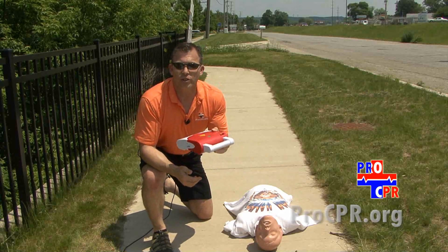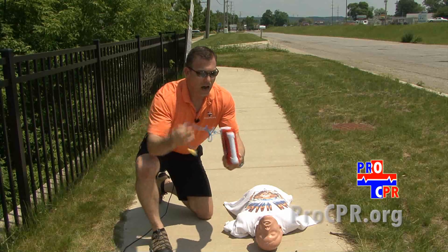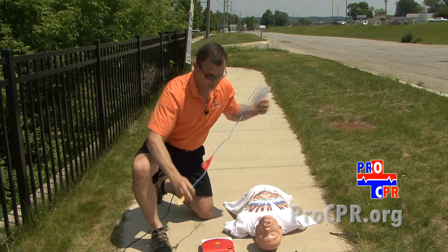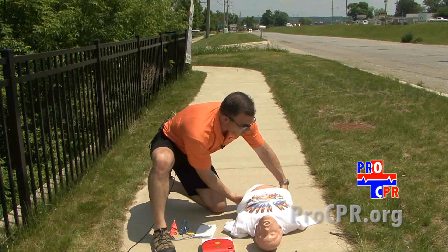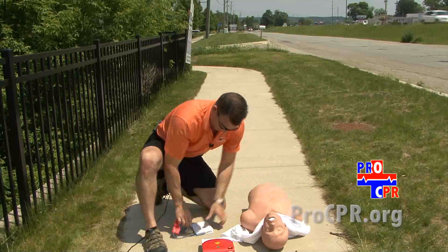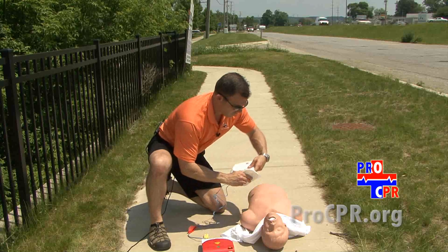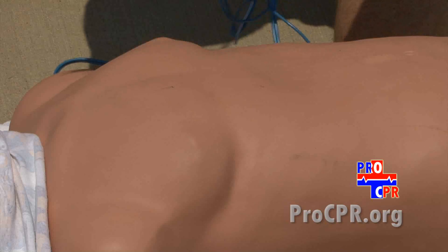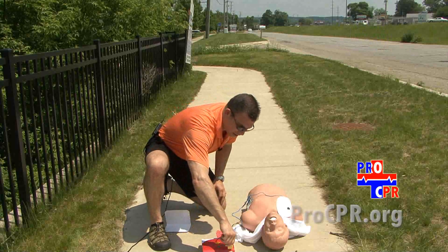AEDs are very easy to use, and once you start them, they tell you what to do. The first thing we're going to do is take the pads out of the AED and turn the AED on. We're going to take the shirt off the person and bare the chest. Then we attach the pads — one underneath the left arm, one above the right breast — and plug in the connector.